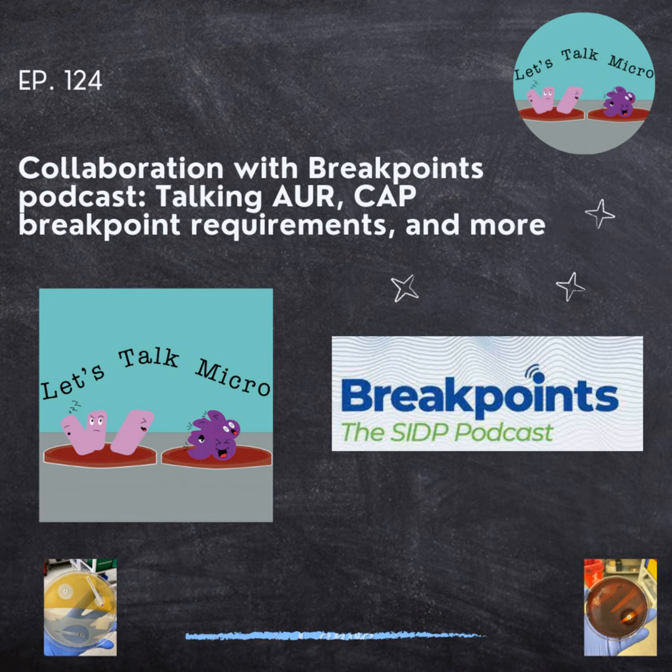So in 2010, 2012, CLSI changed the breakpoints for some of the cephalosporins, and then we have the carbapenems. That was probably the most recent experience where laboratories engaged in validation of breakpoints. Besides that, it's up to every laboratory when they want or need to do it. So the process to update a breakpoint within, say, an AST card or something like that is a little bit different, and maybe labs are not as familiar with that specifically.